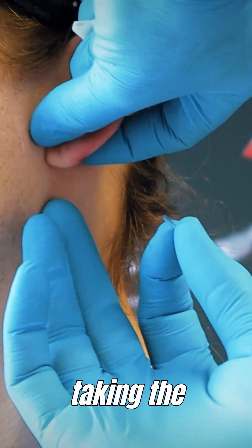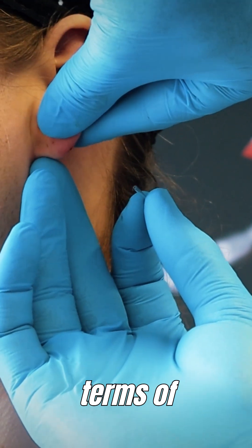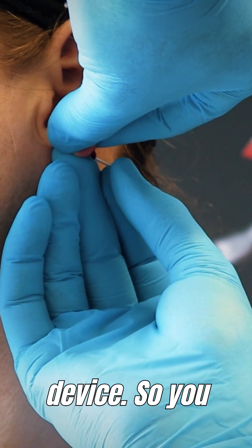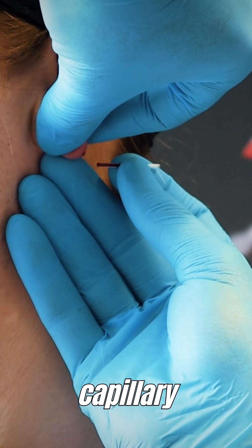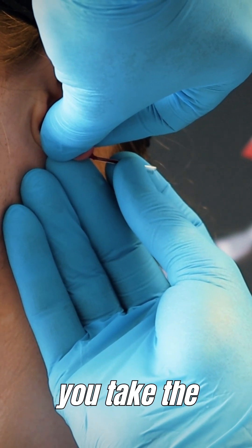We start with taking the blood. You need to be even better at taking the blood samples in terms of forming the triangle, because you need a little bit more blood — normally 20 microliters — compared to a handheld device. You take the blood and then you want to hold the capillary horizontal or pointing downwards when you take the blood.